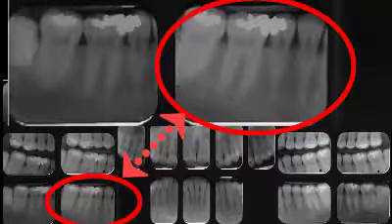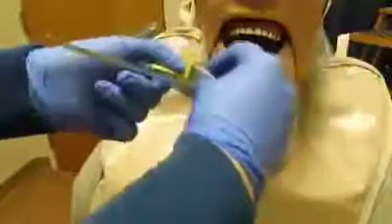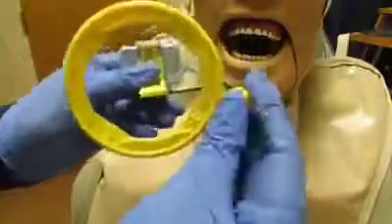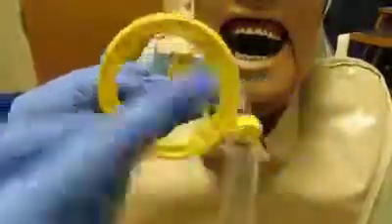Expose the receptor. This image should include all crowns and apices of the present premolars, the distal aspect of the mandibular canine, and the mesial aspect of the mandibular first molar, as well as 2 millimeters below the apices to include their surrounding structures. Then reassemble the ring for the opposite side. The same steps must be repeated.